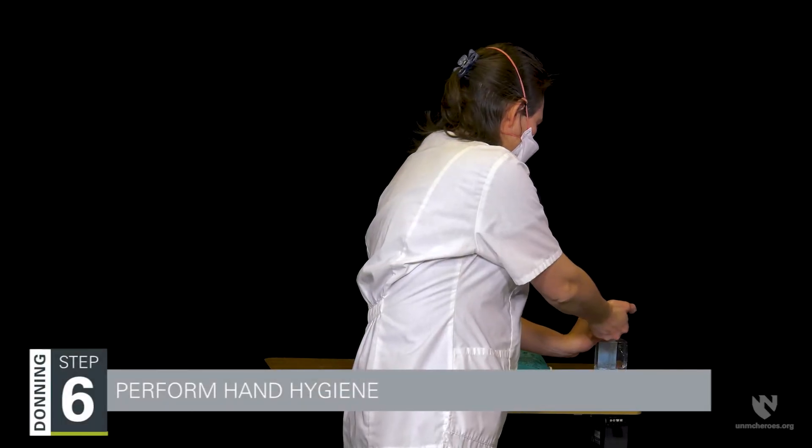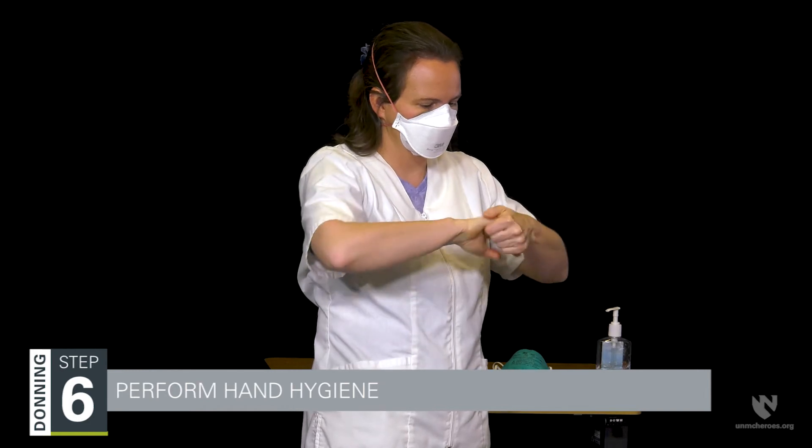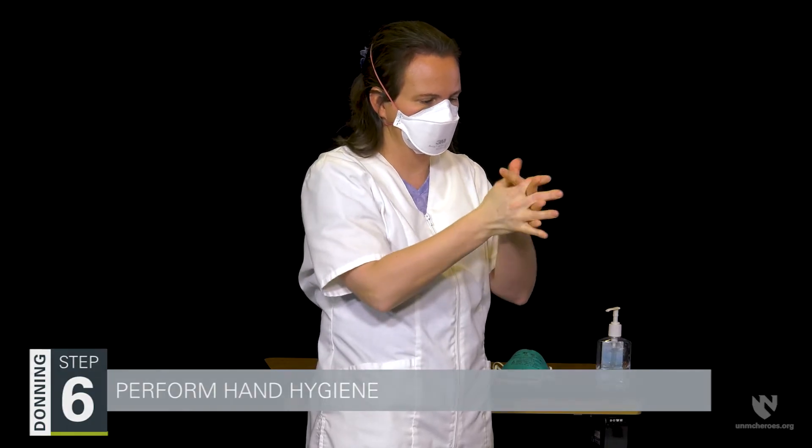Finally, step six is hand hygiene. Hands should be cleaned when all donning steps and the seal check are complete, and should be performed using either an alcohol-based hand rub or soap and water.